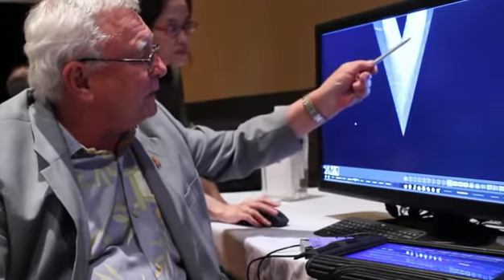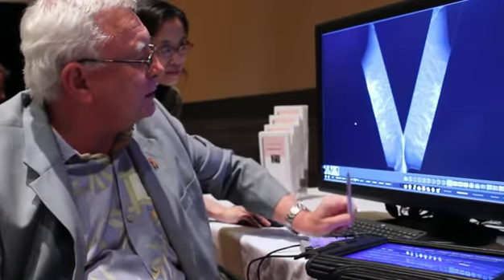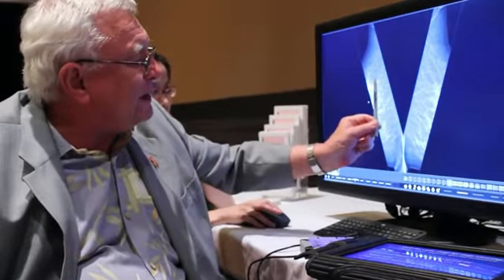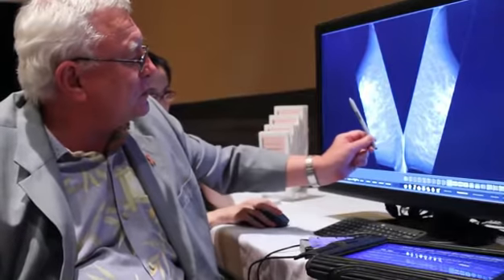So as you see it here, this is the benefit of the masking technique. That is, we start at the edge of the pectoral major muscle, and with one little move, we are going to widen this area, and this is the magic area where 61% of all breast cancers can be found. We are going to look for asymmetric densities, circular lesions, stellate lesions, non-specific asymmetric densities. And look how beautifully the details come out.